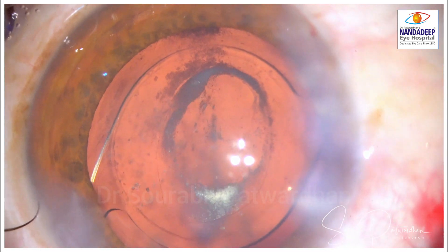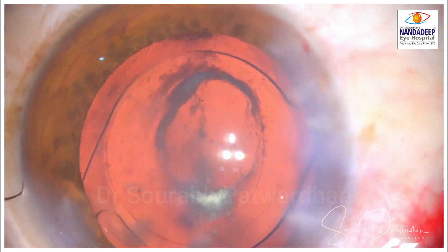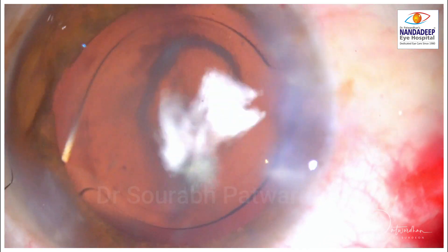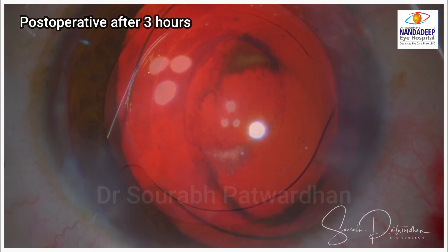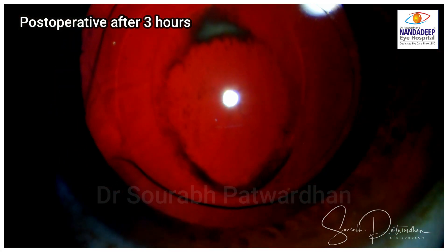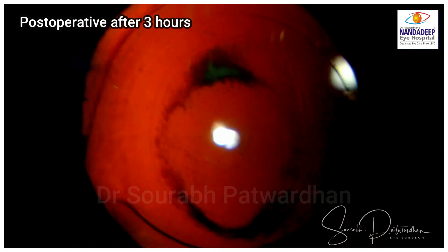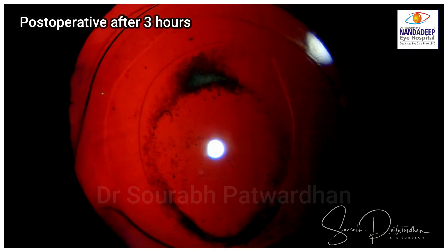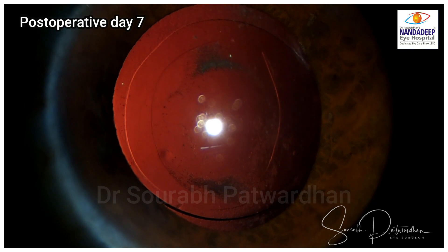You can see the posterior CCC with a few opacities at its margin and some triamcinolone which has gone into the vitreous. This is immediately post-operative, after three hours. You can see the posterior capsule rhexis is very well defined right at the center, along with the anterior capsule rhexis. Those were the opacities on the anterior hyaloid. This is post-operative day 7 and the opacities have reduced.